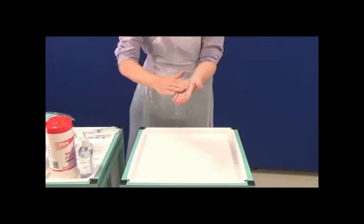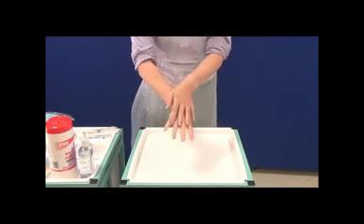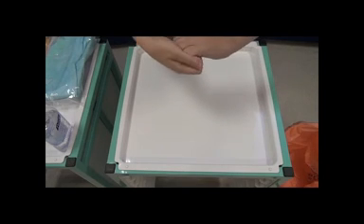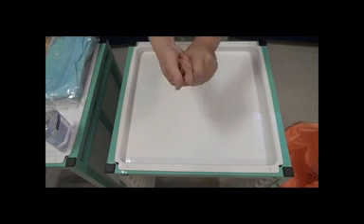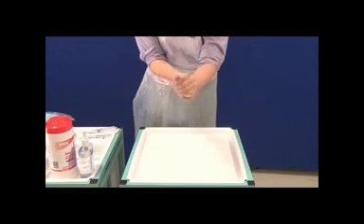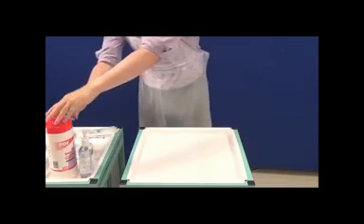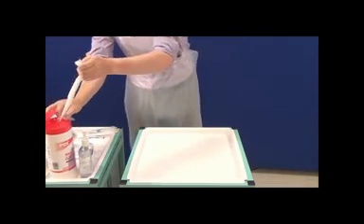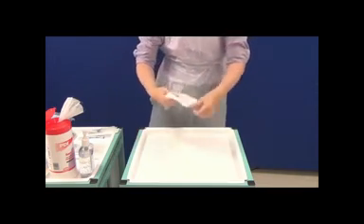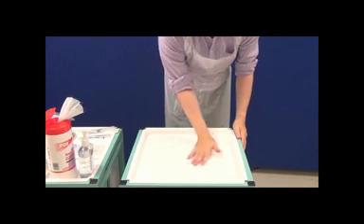So begin the procedure by putting on an apron and washing your hands. Then take a wipe and clean the surface in which you're going to create your sterile field.